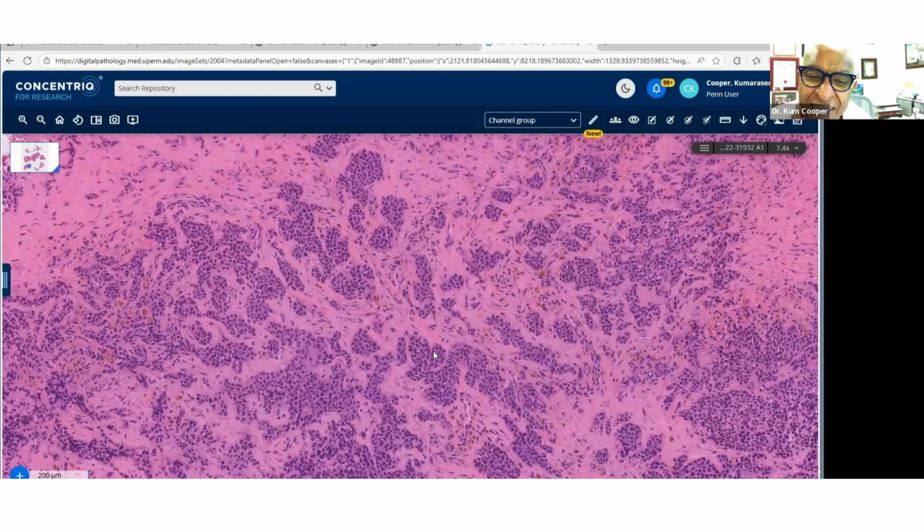Keratin, EMA negative, SMA, desmin negative. I also like calponin for myoepithelioma. I use it for PEComa as well. So it's also useful in that respect. Melanocytoma. Okay, so we've got HMB cooking and we've got EWSR1 cooking. Melanocytoma. I've made a diagnosis of a cutaneous melanocytoma, and I know that these do occur on the meninges as well. So we'll have to wait for the melanocytic markers.